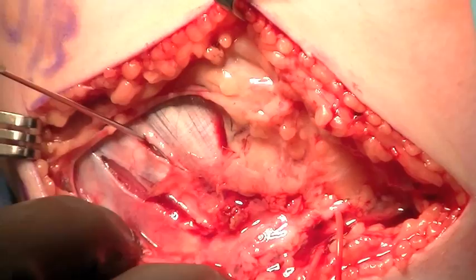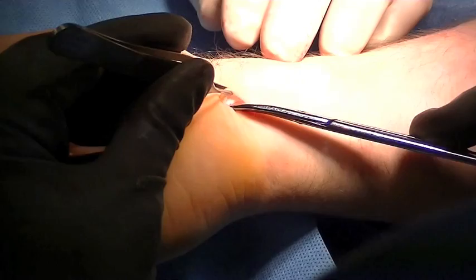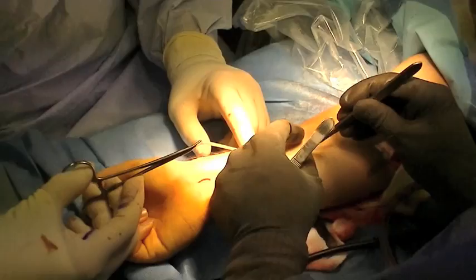The sublime tubercle is identified under fluoroscopy, and then the flexor-pronator origin is split in line with this. The dissection is carried down to the ulna, and the sublime tubercle is mobilized.